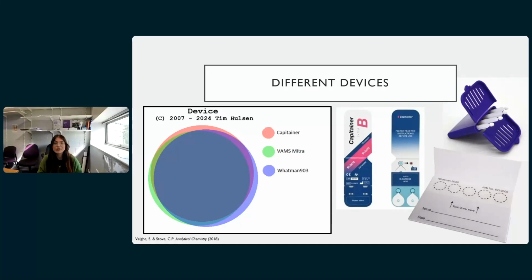So when looking at microsampling or remote sampling, there are a lot of companies claiming to produce the most foolproof and volumetric tool. Now, as far as clinical settings go, when you discuss microsampling, as Cash mentioned earlier, you're probably thinking of the Guthrie test, which is that test that they perform on newborns at 5 days old, little heel prick, get the blood, test them for 9 different metabolic disorders. Now, that uses either the Whatman 903 filter paper, which is pictured on the screen, or the Ahlstrom 226 filter papers.